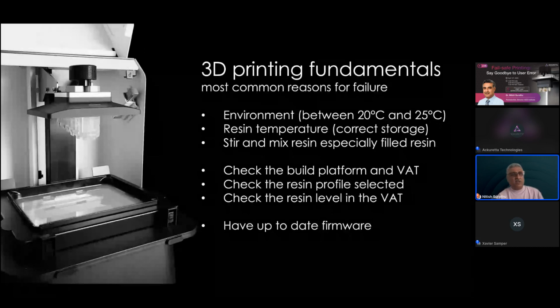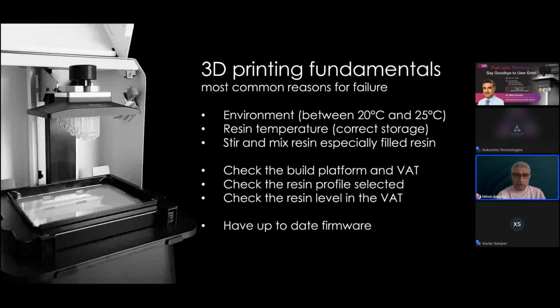And so if you're going in anywhere below 18 degrees, forget it. You're not going to get many successful prints at all. In fact, if you go below 20 degrees, you're probably going to see some failures, in my opinion. A lot of companies will say 18 to 25 degrees is okay, but I really would prefer that range to be somewhere between 20 and 25.